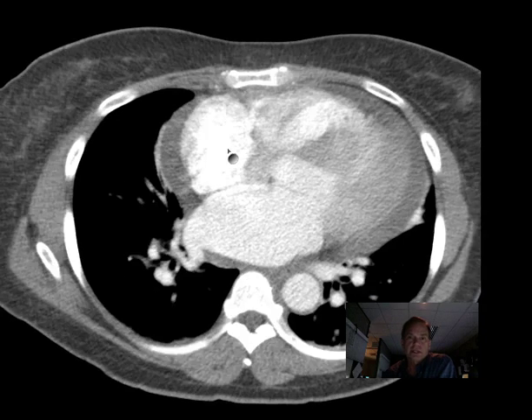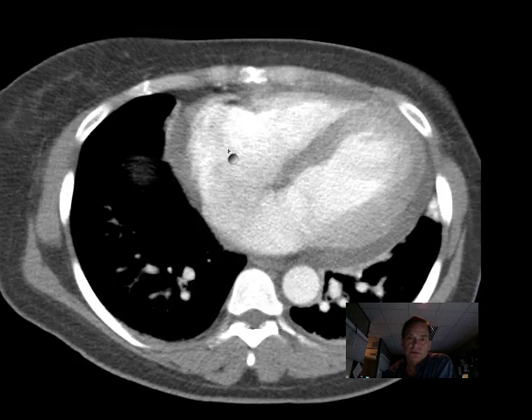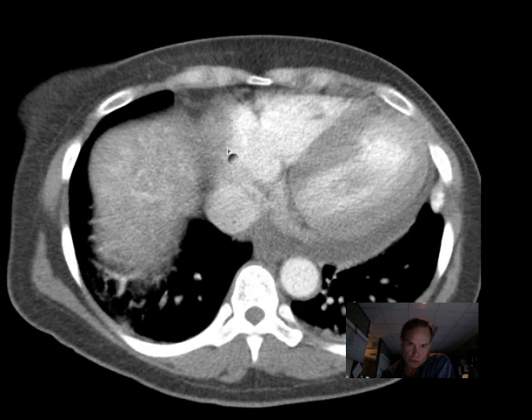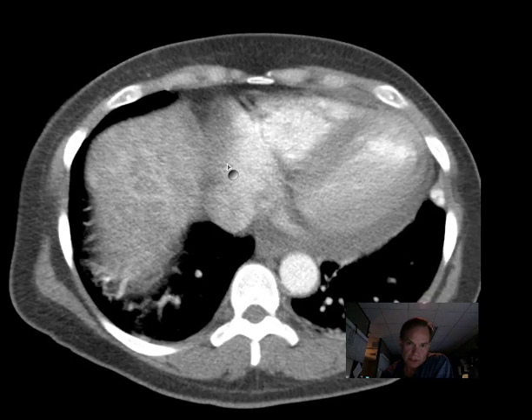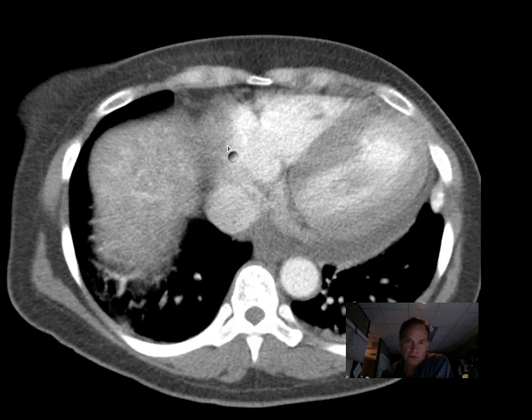If you follow the right atrium down farther, you will encounter the inferior vena cava, which is this structure right here.